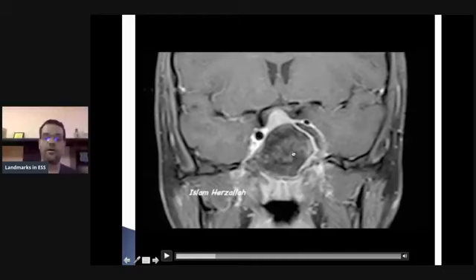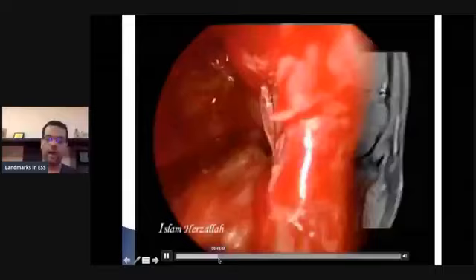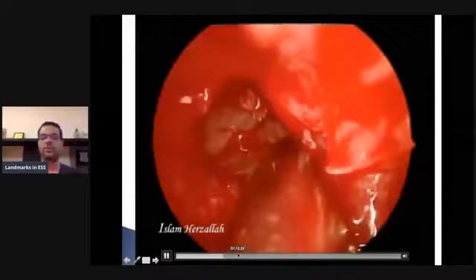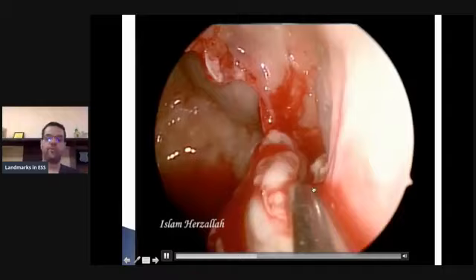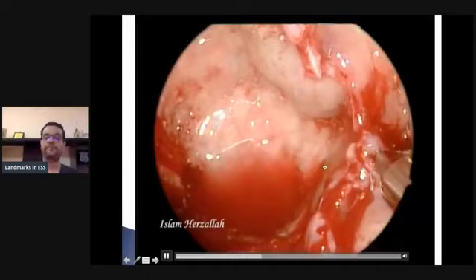So what I've done is an extended sphenoidotomy and posterior septectomy, pretty much what you do for a pituitary surgery, and then clearing all the cells inside the sphenoid sinus. And I'm going to show you this region. So you see, I'm now working at the very narrow area that I showed you in the CT and the MRI scan on the left side. And I'm taking down this region.